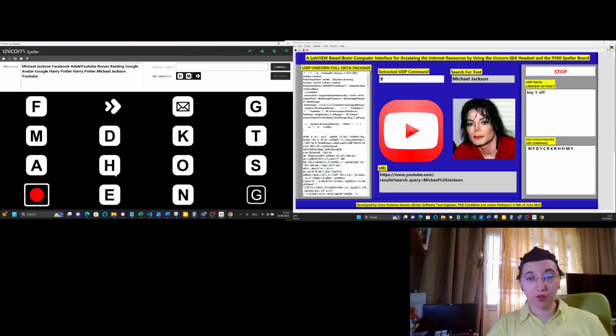selection. I'll try again to focus my attention on the H symbol for searching for Harry Potter in YouTube. So firstly, I try to select Harry Potter and then I try to select again the YouTube.